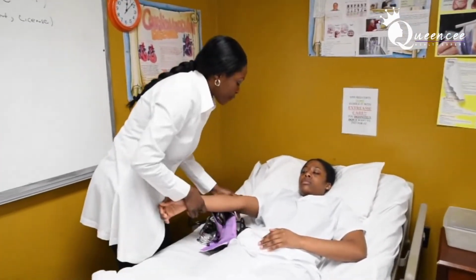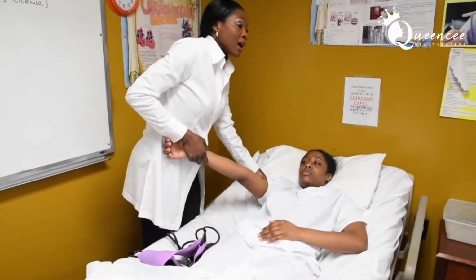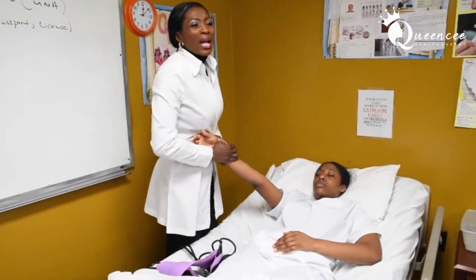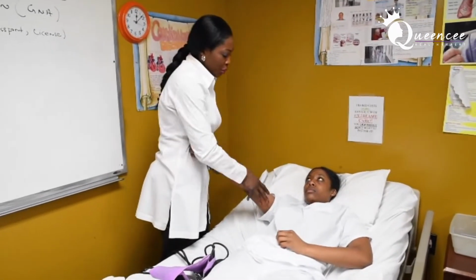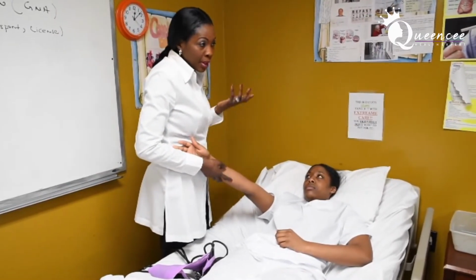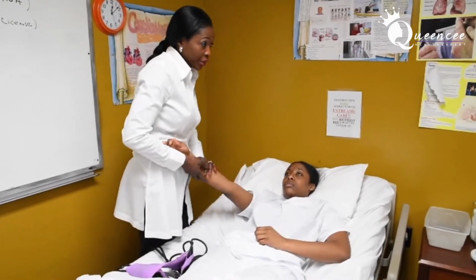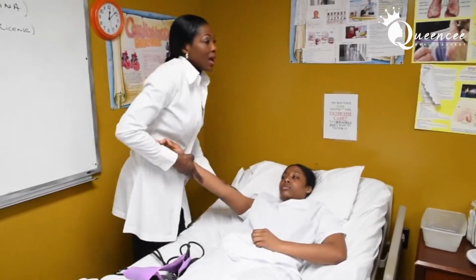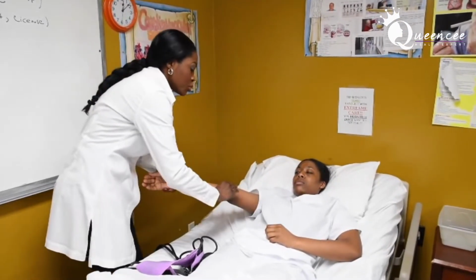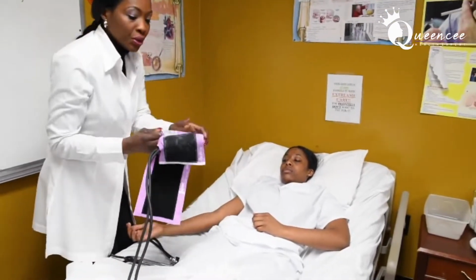We already learned from our lectures that when you're taking blood pressure, the patient's arm should be exposed. In this case, it's very easy, unless your classmate is wearing a sweater underneath their uniform the day of the exam. But if they are wearing a sweater, then you would move it out of the way to expose the upper arm, that's exposing the brachial artery. Okay, so that's what we're doing.